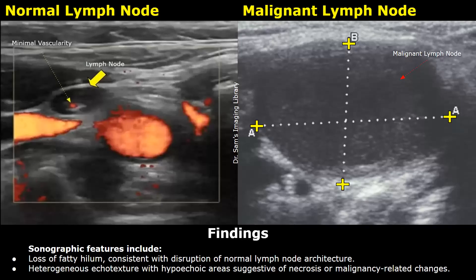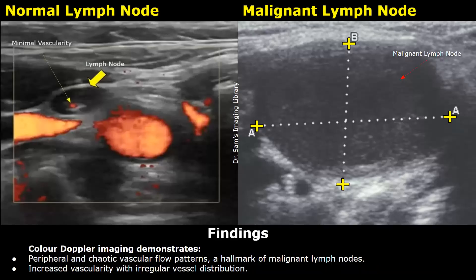Sonographic features include loss of fatty hilum, consistent with disruption of normal lymph node architecture, and heterogeneous echo texture with hypoechoic areas suggestive of necrosis or malignancy-related changes. Color Doppler imaging demonstrates peripheral and chaotic vascular patterns — a hallmark of malignant lymph nodes — with increased vascularity and irregular vessel distribution.